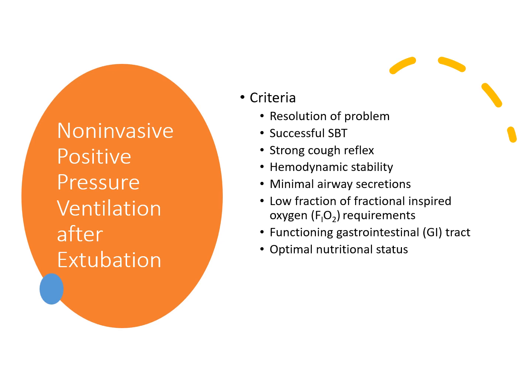So there's a lot of potential benefits for using non-invasive after extubation, especially for patients that just need a little transitional ventilator support. So you can do it temporarily for subglottic edema to give medications that reduce swelling like corticosteroids and give those time to take effect. But you can also use it for preventing reintubation when respiratory failure occurs after you extubate.